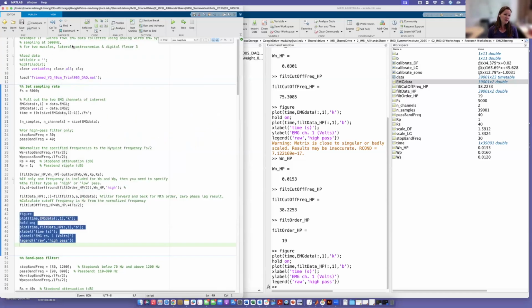One thing you'll note in the literature is that people often rectify EMG signals, because the positive versus negative spikes aren't meaningful, right? And so they just show the rectified EMG. It's important not to do your high pass filter after rectifying. That will introduce weird artifacts, because the whole signal is now above 0, and when you filter it with the high pass filter, it may reintroduce cases where it goes below 0 because it's trying to fit that weird shape, right?